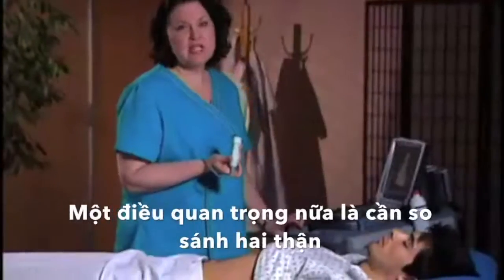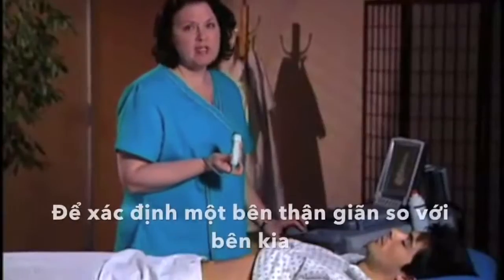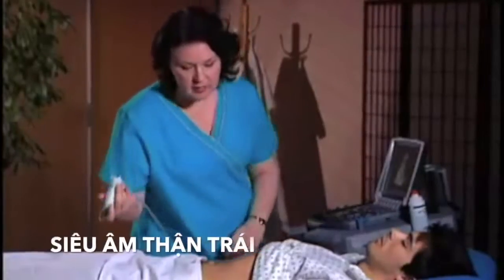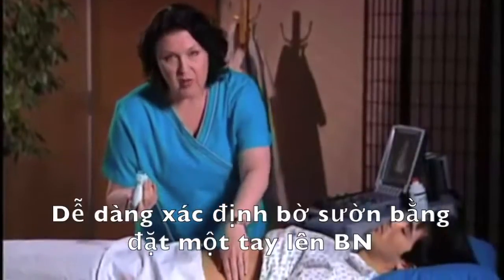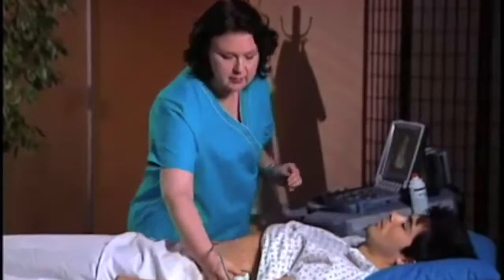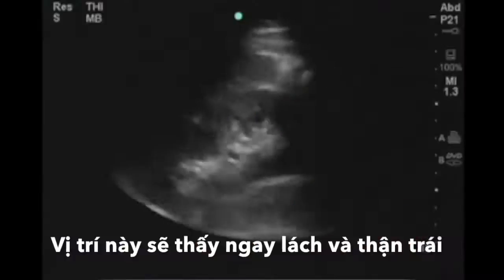An important part of the kidney evaluation is a bilateral comparison between the right and left kidney to determine if there's hydronephrosis present on one side versus the other. So we'll go ahead and do the left side as well. An easy landmark here is to identify the costal margin, move up one hand's width, and bring your transducer in at the mid-axillary line. This should get us right in the area of the spleen and the kidney.